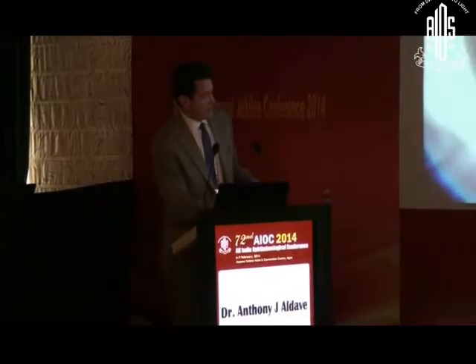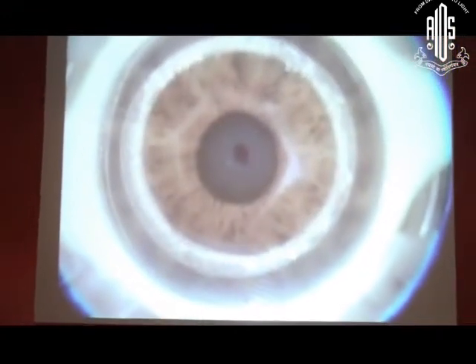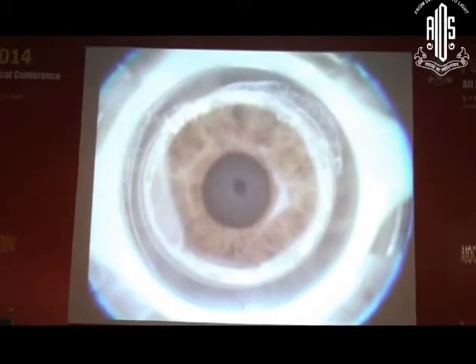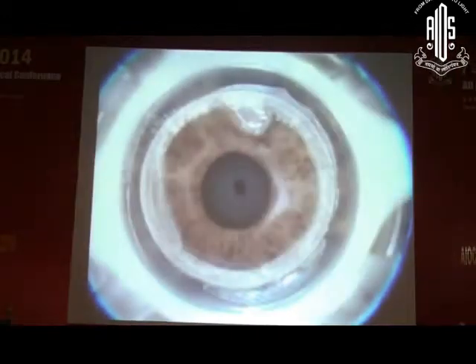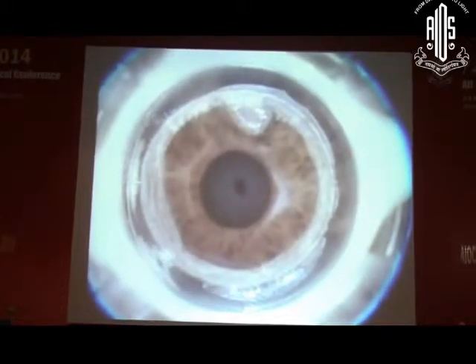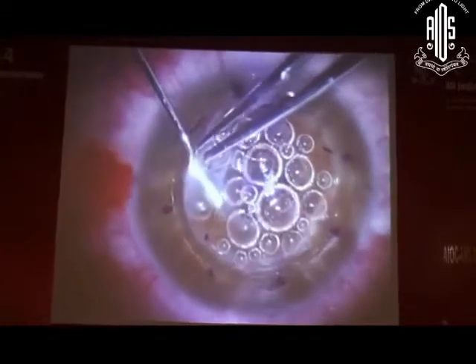For those of you who have not seen the femtosecond laser used for keratoplasty, this is a patient of mine who had previous hexagonal keratotomy, an older treatment for hyperopia. We see here the zigzag edge profile. It starts with a posterior side cut, then moves anteriorly, ring lamellar cut, and then this anterior side cut. You see where the air bubble now is broken through, and then the creation of these radial alignment marks. You can make anywhere from 4 to 12 of those to help with tissue distribution.